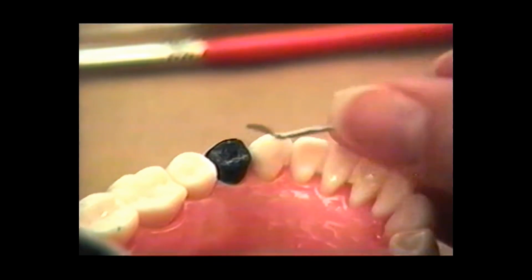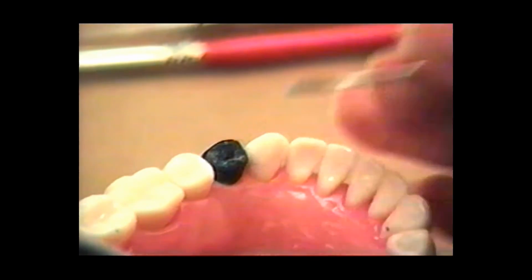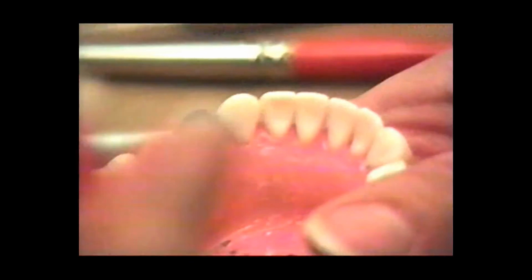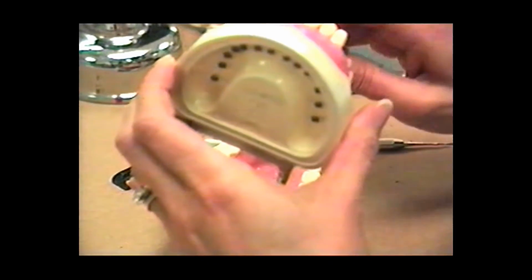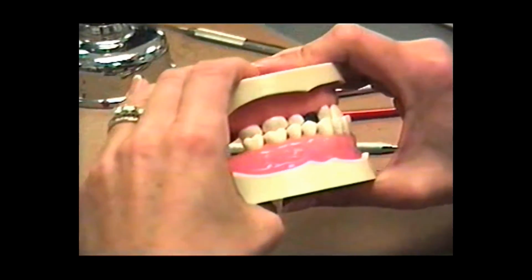And then my other contact was down here. I'm going to get that down too. Let's see if we're close. Maybe I'll put a little more powdered sugar on, but you don't need tons of powdered sugar to see this. If you put too much, it gets goopy and it starts to get sticky like a bad donut. So go ahead and squeeze it.